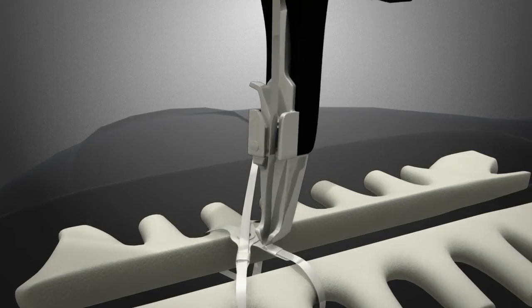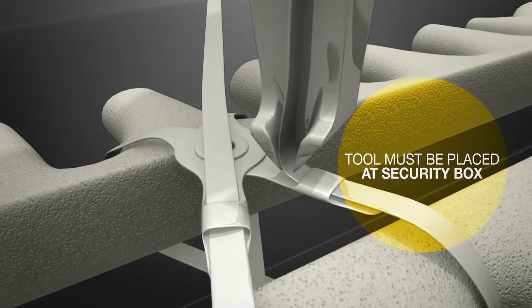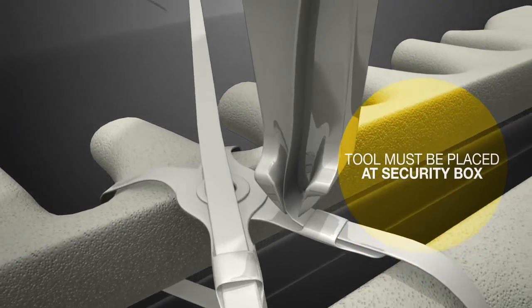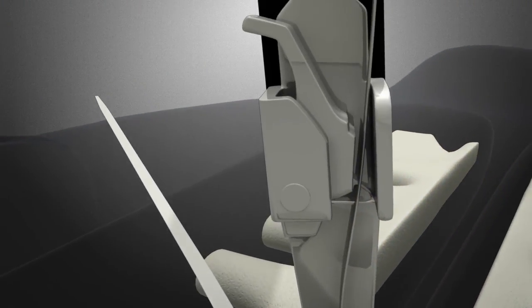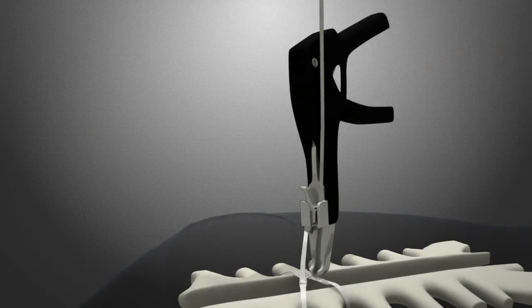The clamp at the end of the strap is controlled with one hand as the tool is placed onto the strap. The tensioning tool is kept at the security box and the strap is placed in the tensioning mechanism. By keeping your hand together and in alignment, the strap will remain in the mechanism.